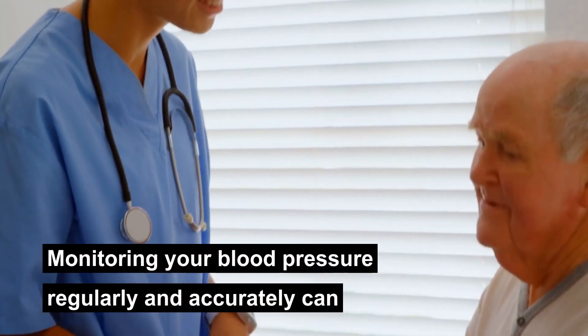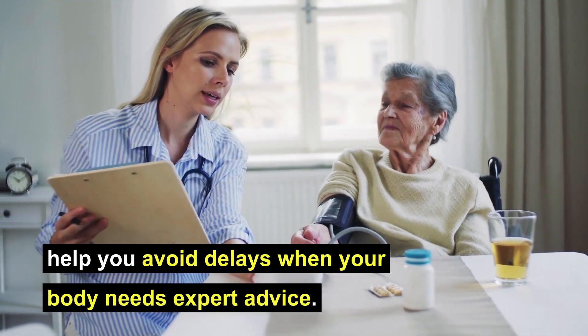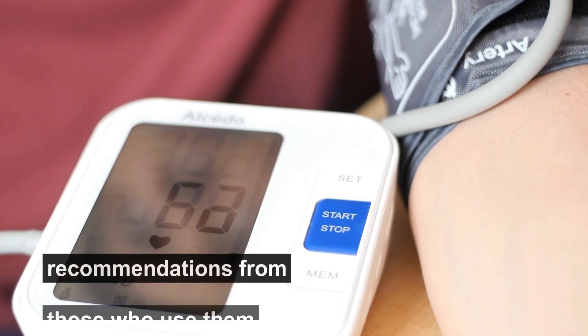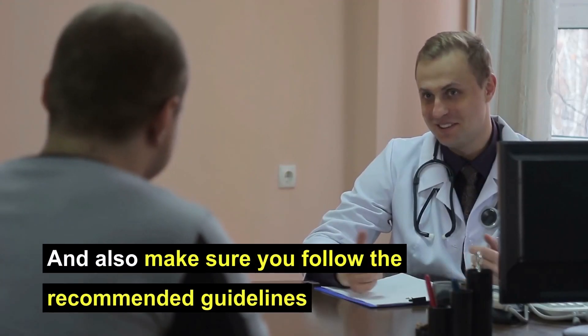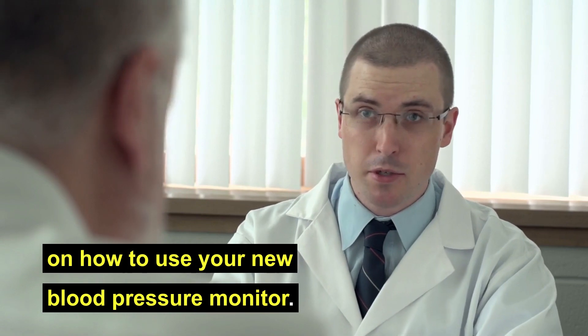Monitoring your blood pressure regularly and accurately can help you avoid delays when your body needs expert advice. Be sure of the device you buy, even getting recommendations from those who use them or by checking out reviews online. Also make sure you follow the recommended guidelines on how to use your new blood pressure monitor.